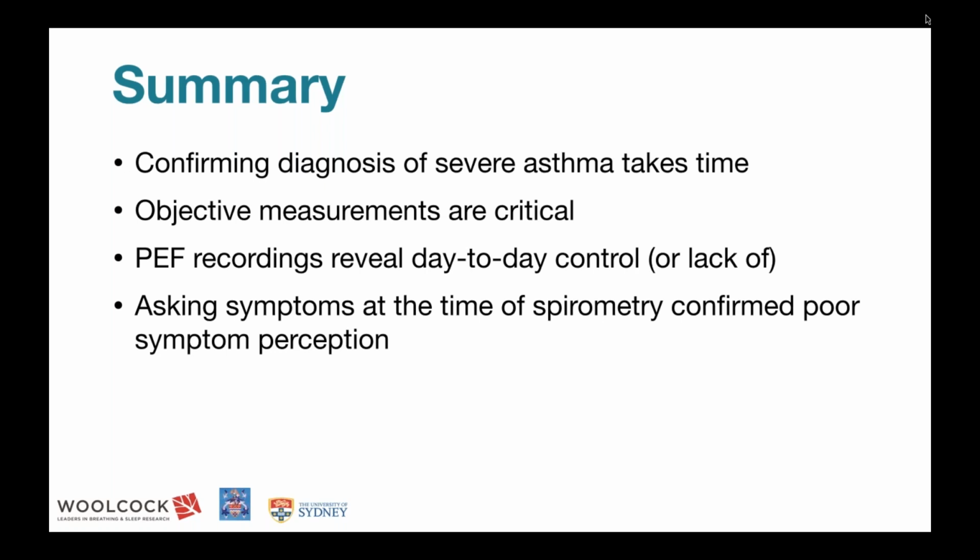Peak flow recordings reveal day-to-day control or lack of it. And I strongly believe in the value. In fact, I believe that anyone who's working in a severe asthma clinic or sees a lot of asthma should be very, very au fait with peak flow recordings and being able to get their patients to use it. Of course, we wouldn't expect everybody to use it every day for the rest of their lives. That would be completely unreasonable.